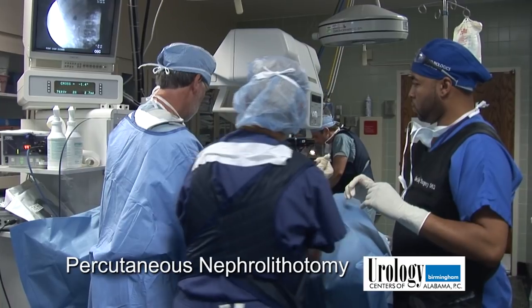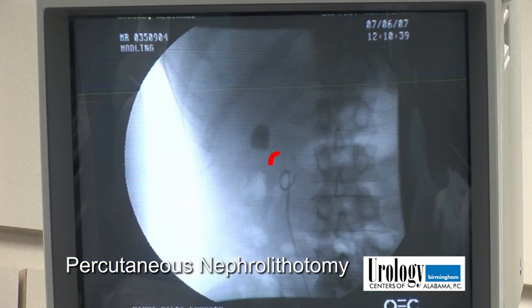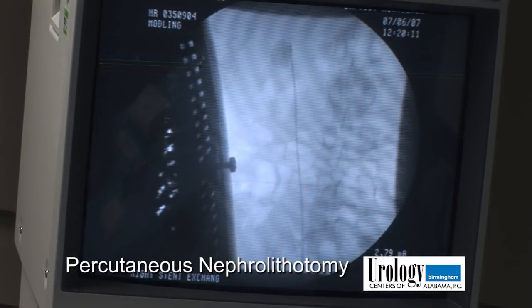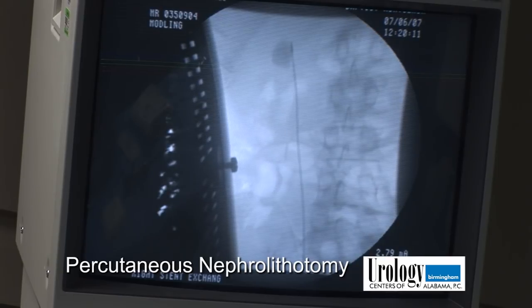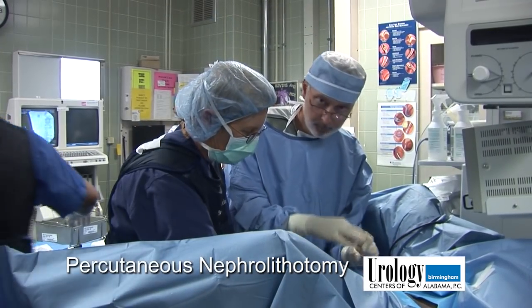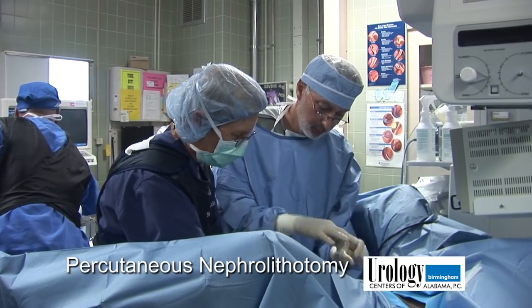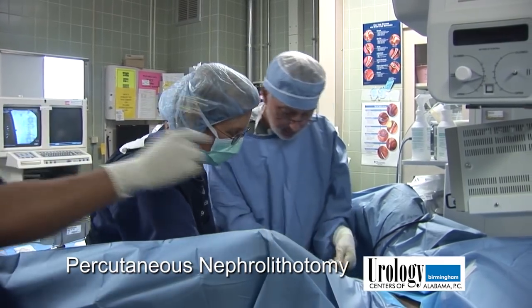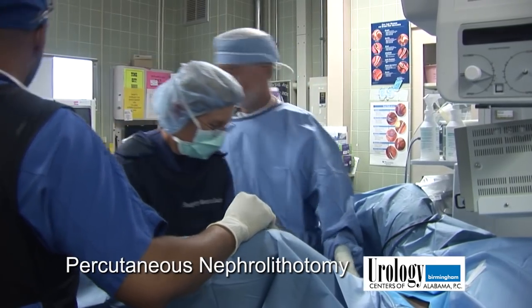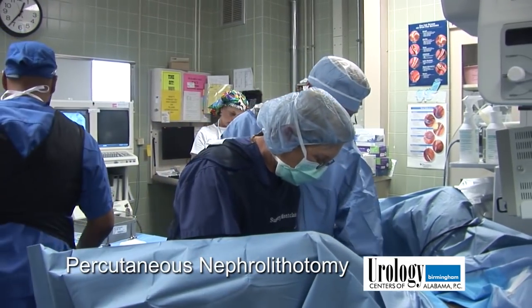First thing I'm going to do is grab his stent and remove it. What we did is place a catheter into the right kidney so we can inject dye so we can visualize the stone and where the stone is going. The next step is we're connecting the catheter and the Foley catheter so that these don't dislodge when we move the patient.